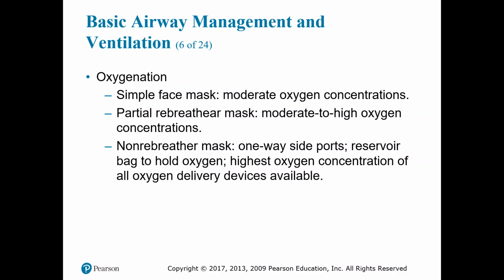So a simple face mask is indicated for patients requiring moderate oxygen concentrations. The side ports allow room air to enter the mask and dilute the oxygen concentration during inspiration. So the simple face mask is the same as our non-rebreather masks, except where the non-rebreathers have the little flutter valves on the air exhaust ports, where the patient would exhale, there are no valves there. There's just the holes. And there's no reservoir bag.